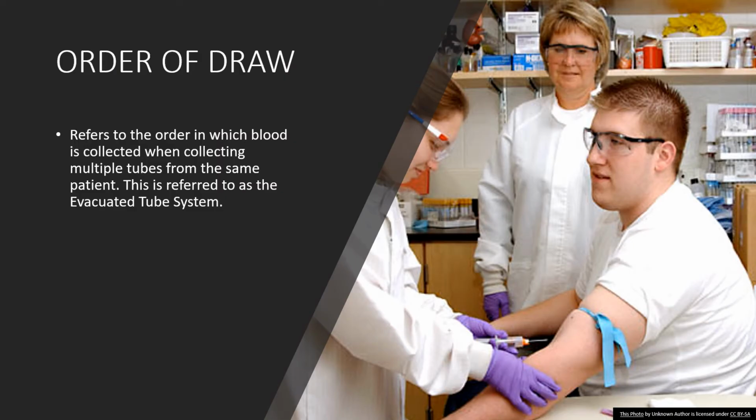Okay, so order of draw. This just refers to the order in which the blood is collected when you're collecting more than one tube, right? And the system that we want to use most often, because it's the safest and easiest to use when drawing multiple tubes, is the evacuated tube system.